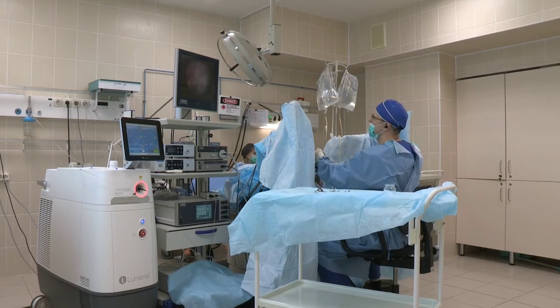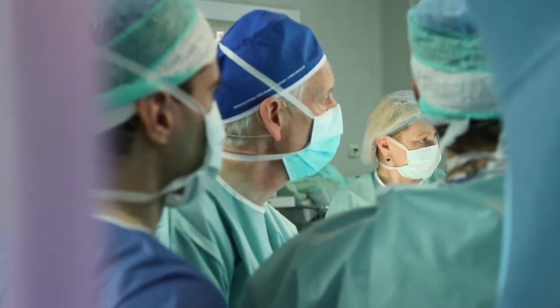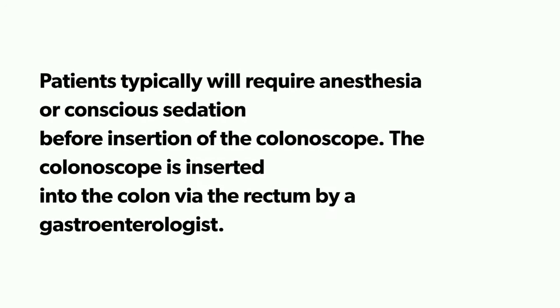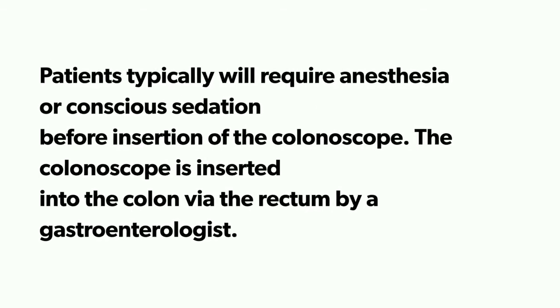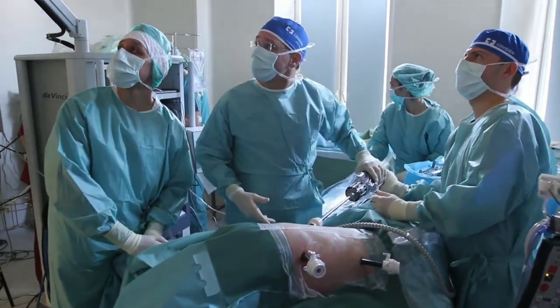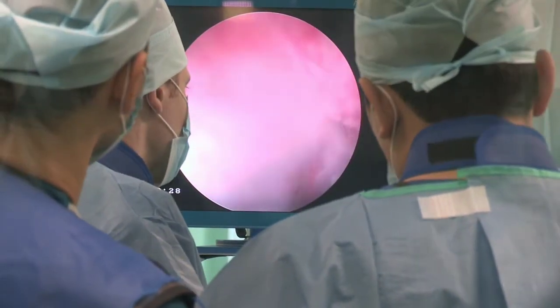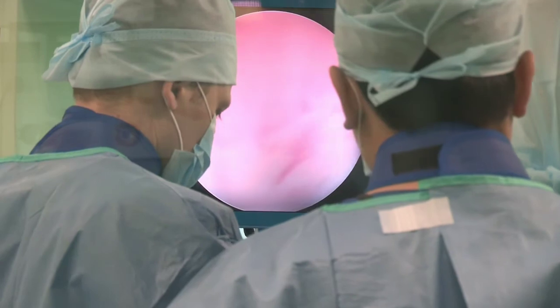So how do these steps work? The patient is typically laid on his or her side on a procedure table. Patients typically will require anesthesia or conscious sedation before insertion of the colonoscope. The colonoscope is inserted into the colon via the rectum by a gastroenterologist. These video images are typically viewed throughout the procedure on a video monitor. These images can then be recorded, printed or stored on digital media, or even transmitted to another location for simultaneous viewing. So this gastroenterologist manipulates the direction of the device using the controls of the colonoscope control housing.